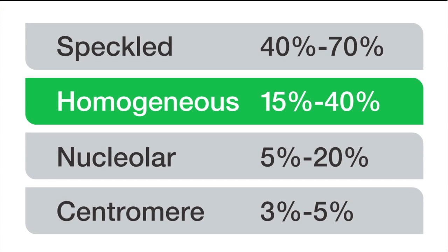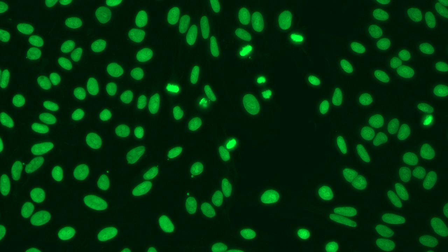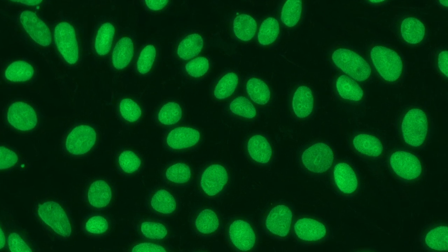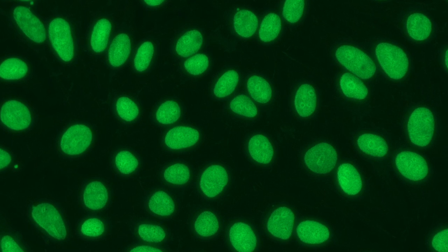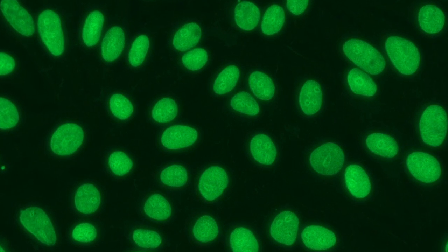Now let's take a look and see what a homogeneous pattern looks like. First, look at the nucleus of your interphase cells. Remember, the majority of the cells that you see on the slide are interphase. In a homogeneous IFA pattern, the nucleus will have an even staining throughout.